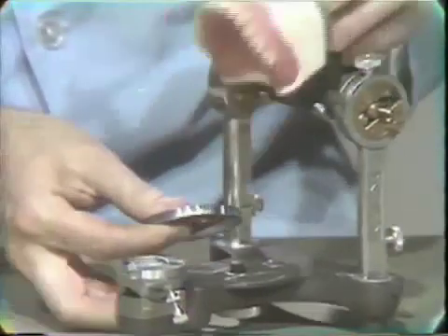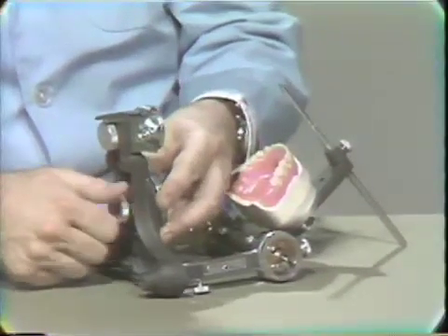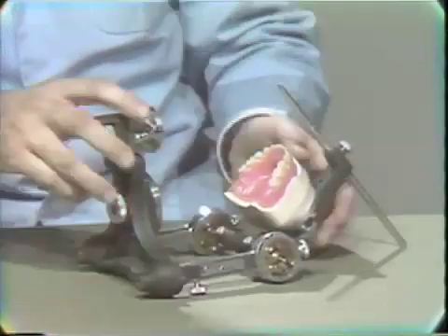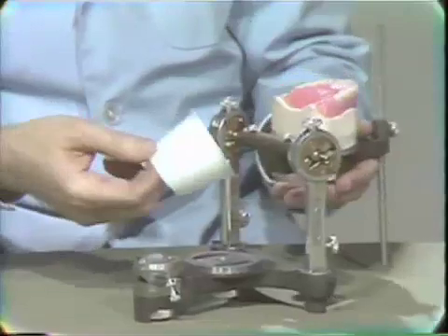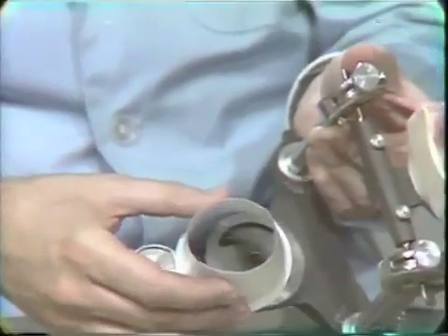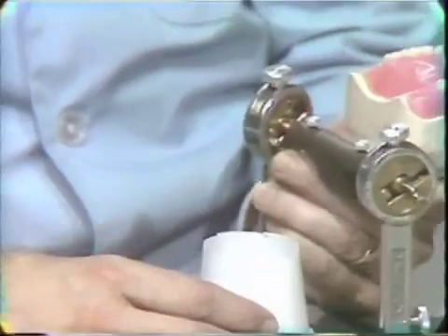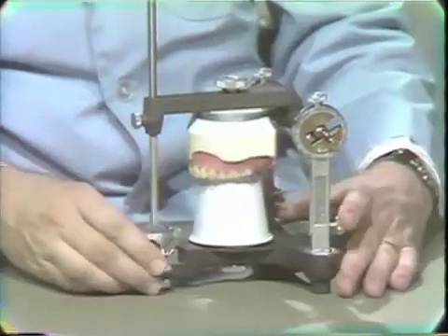So the first thing we do is simply take a new ring and place it on the articulator. Make sure it's all the way down. Then one easy method is to simply take a small drinking cup and cut part of the top off. You'll notice that these do fit over the ring quite nicely. We cut it down only to the point that when we close the articulator, it becomes just short of the cup itself.